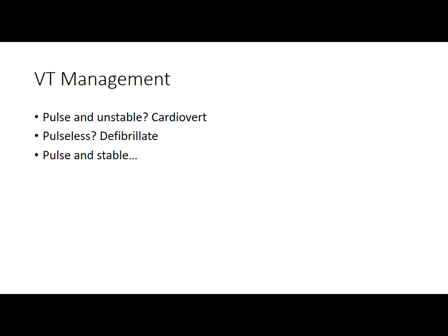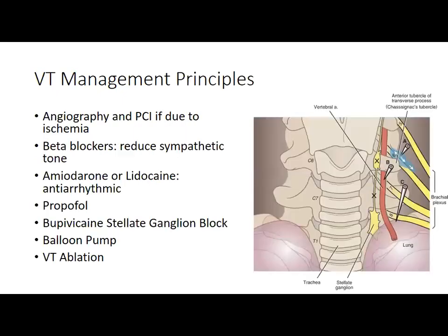Because it's a ventricular beat, it's going to be wide. That ventricle is just not contracting well. It's really circular. It does not contract as well as it would have if that electrical activity was going down your His-Purkinje to give you a nice uniform conduction. So if you're in the CCU and you've got a patient who's at a heart rate of 100 and all of a sudden they go to 110 and it's wide and they've got a history of VT and maybe they're there for VT, it could be slow VT and they will most likely become a little hemodynamically unstable because that ventricle isn't contracting as well.